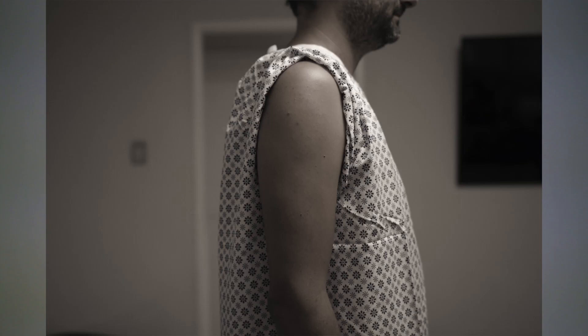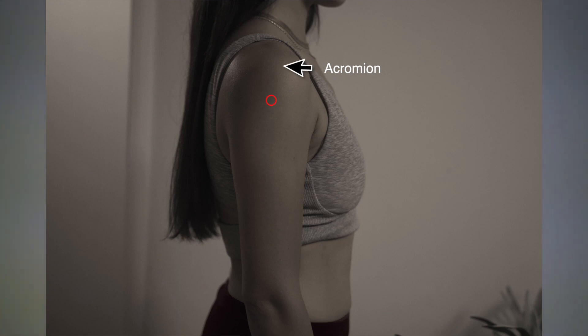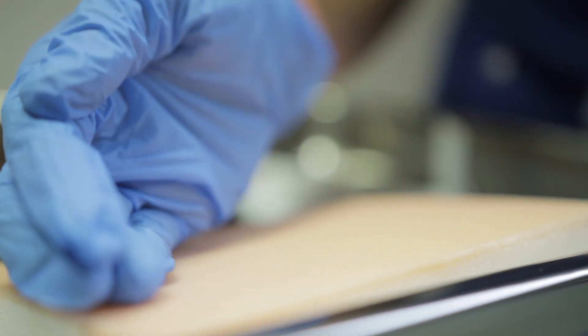For the adult patient 19 years of age or older, the deltoid muscle is the recommended site for IM vaccinations. For males and females less than 130 pounds, some experts may use the Z-track method with a 5/8 inch needle only if the skin is stretched flat, to prevent medication from going into subcutaneous fat, at a 90-degree angle. Ask the patient to relax their arm — tensing up causes more pain. Locate the acromion process, go 2 fingers down, inject with the bevel facing up at 90 degrees using your dominant hand. Do not aspirate, then withdraw the needle and dispose in a sharps container.